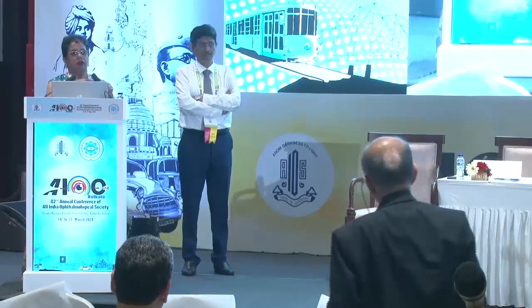The concept is, we had done a table tennis ball which we were cutting in half and sticking either a carbon sheet or a printed mock fundus on, and using it for laser practice. When I did this, thermocol was not available, but now thermocol also is there, so fixing it is quite easy.